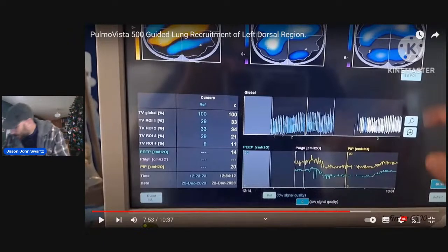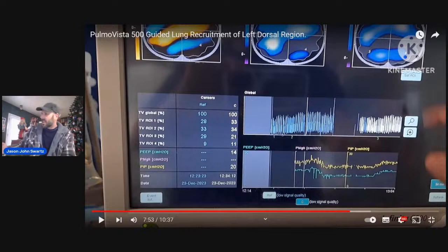This case, for example: a guy intubated for non-pulmonary reasons. We start with a PEEP of 6, right? Because he doesn't need much oxygen. Well, two days into it, he's on 40% now. What if we don't catch that, and now he has something even more serious here?